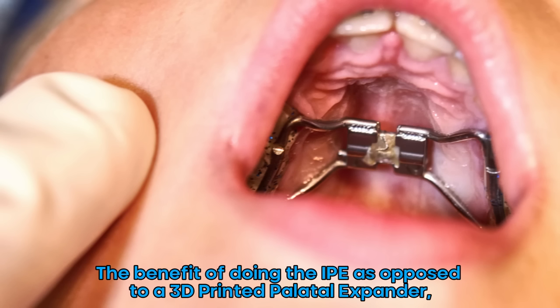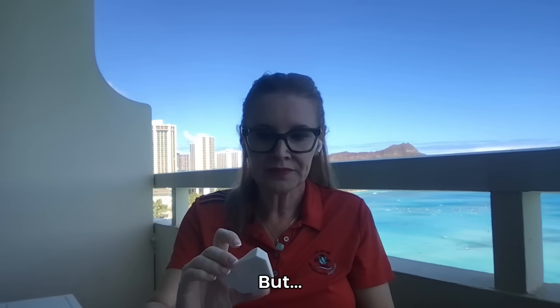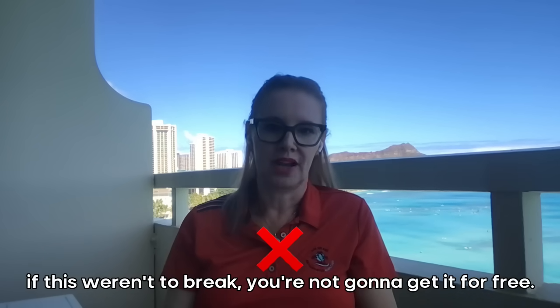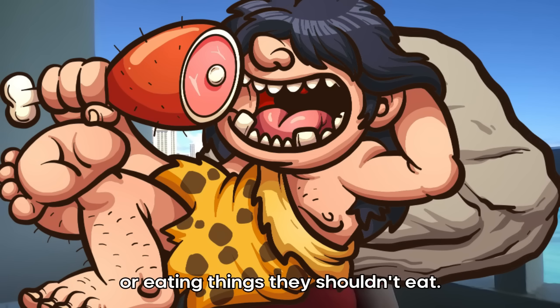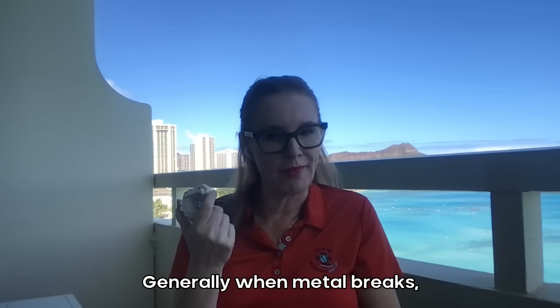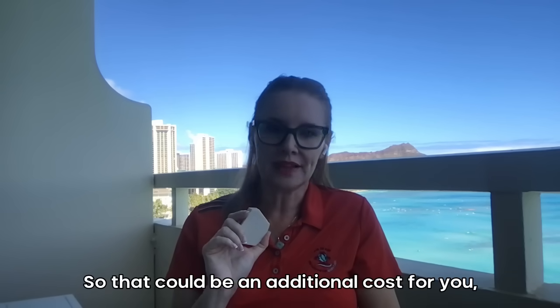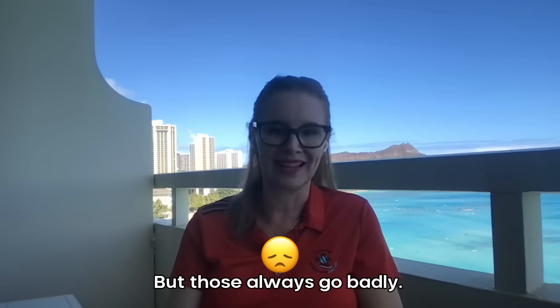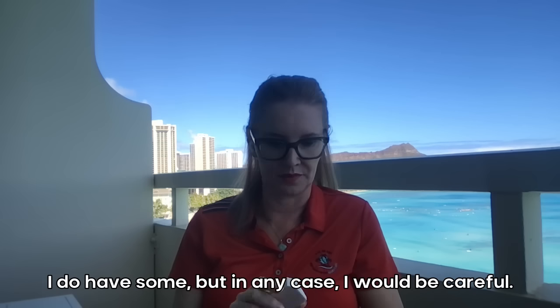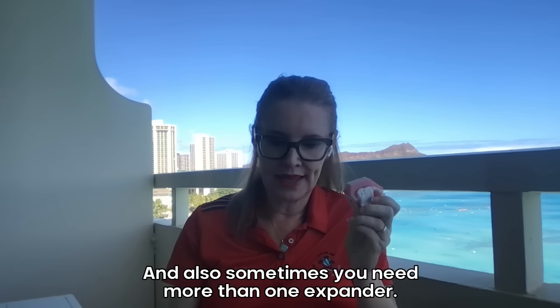I'm a big fan of this. The IPE is not cheap. The benefit of doing the IPE as opposed to a 3D printed palatal expander — obviously price is not a benefit because it's like four, five, six times the price. But if it were to break, you're not going to get it for free — you're going to have to pay for another one. Generally when metal breaks, unless I catch them doing something, I'm going to eat the cost. That could be an additional cost for you unless you create some type of compliance agreement, but those always go badly — so be very cautious.